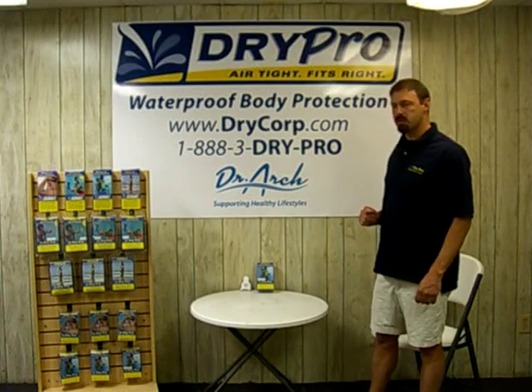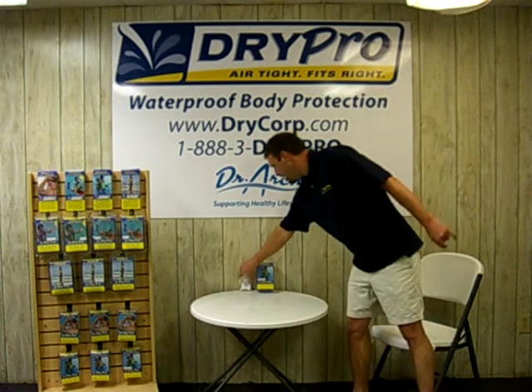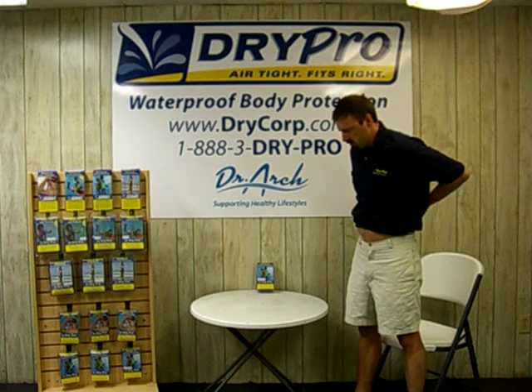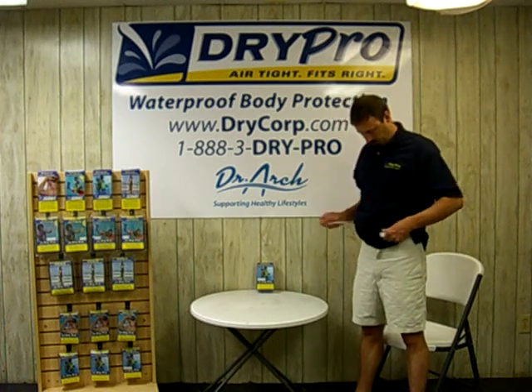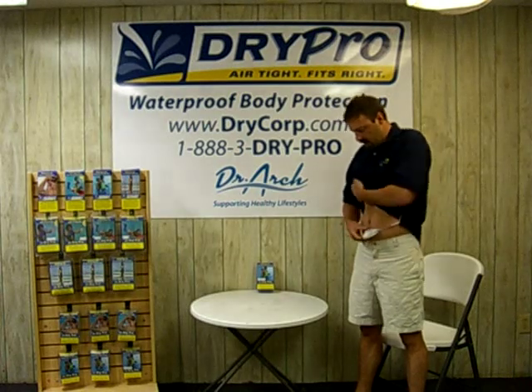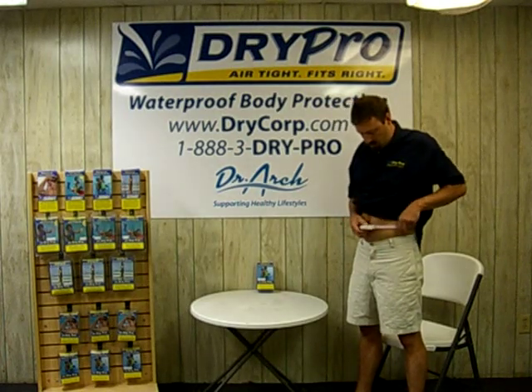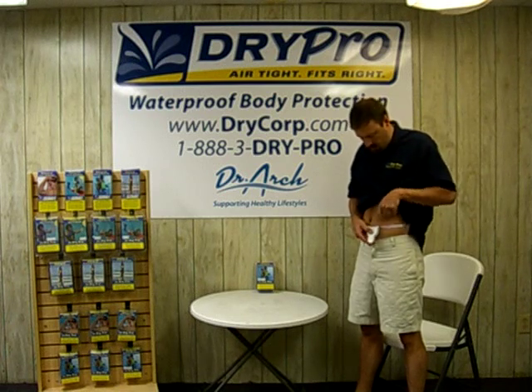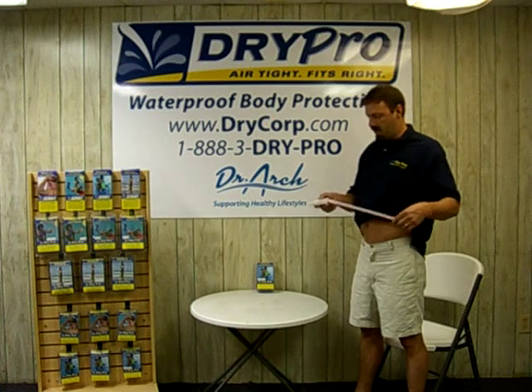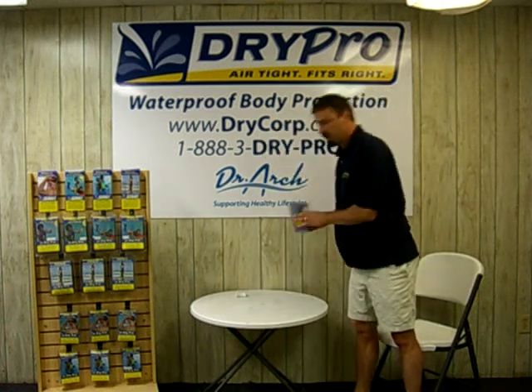We are here today to demonstrate how to use our DryPro waterproof ostomy protector. I am going to determine my correct size. What I need to do is take a measurement around my ostomy site — this would be if my ostomy was up here. On our website DryCorp.com it has the size chart, and I can see that I need a small ostomy.